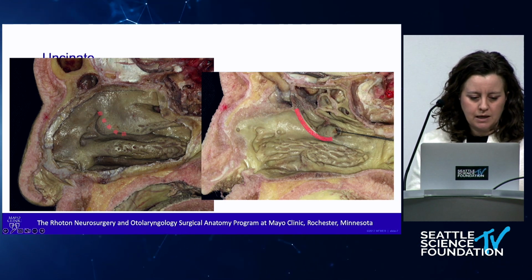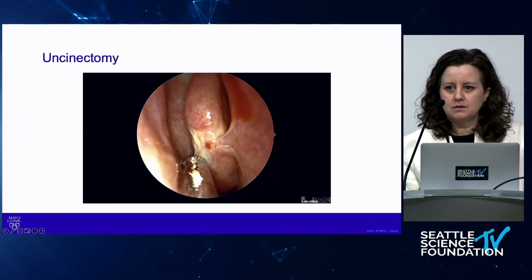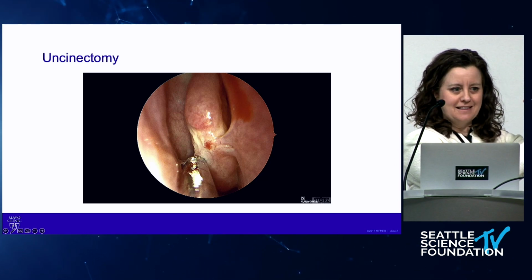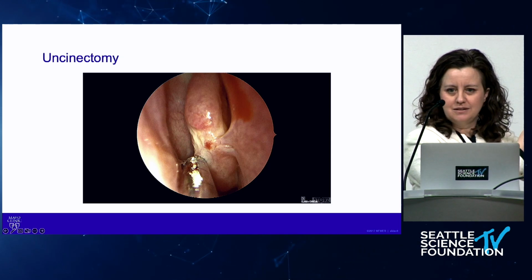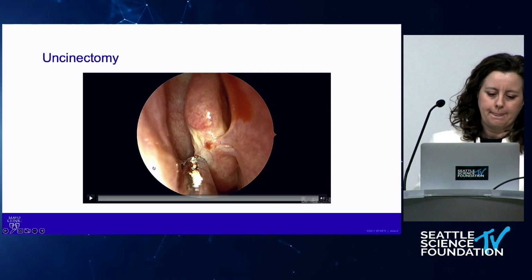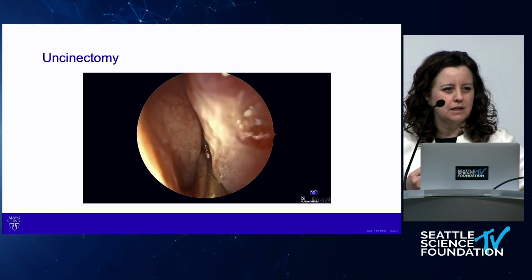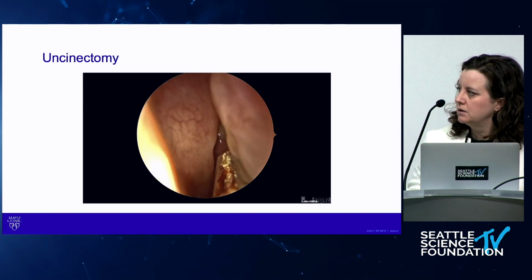I'm going to show you my uncinate model that is with you all the time. This is your uncinate. I tell the residents, hold up your hand. This is your uncinate. Your maxillary sinus is right here on your thenar prominence. I say, this is what we have to find. So you got to take the uncinate down to find the maxillary sinus. So I tell them, you have got your uncinate model with you always. I didn't realize until Brad said it, there's actually a name for this, Parsons technique, I guess, he said, to take down the uncinate. So gently pushing the turbinate medial.